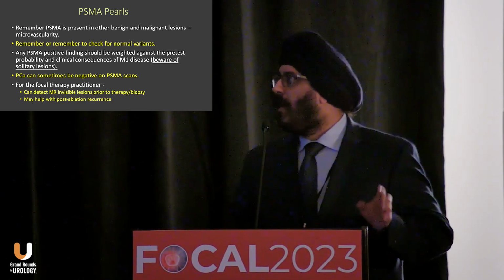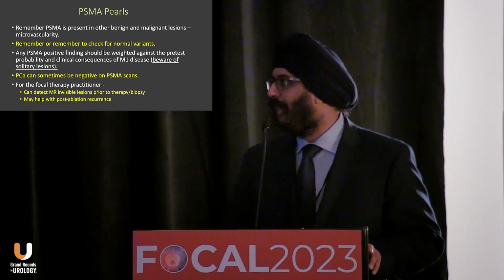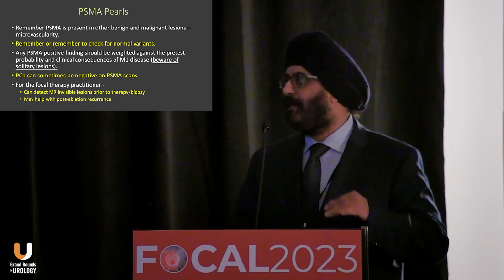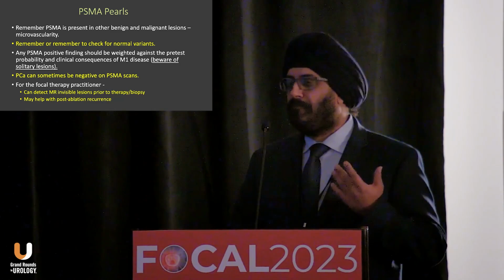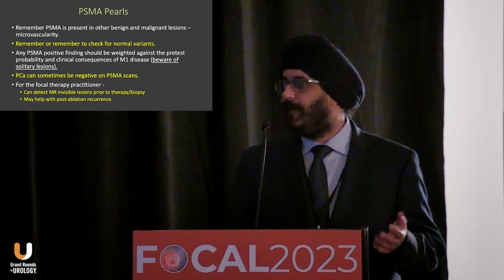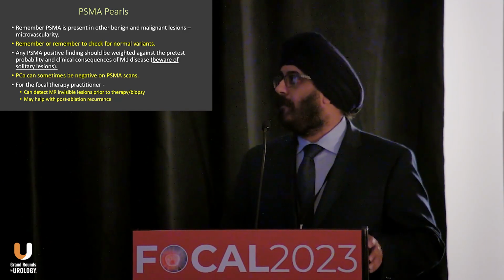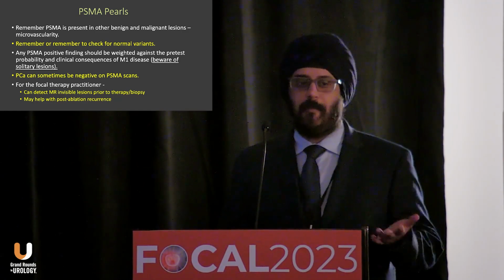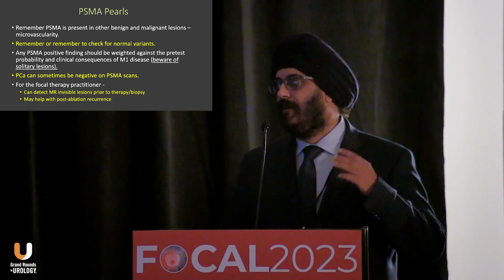All right, so just to start out with getting the pearls out of the way, PSMA is prostate-specific membrane antigen, but it basically targets a lot of vascularity, neovascularity, and any lesion which has neovascularity can have PSMA positivity. You can't remember all the normal variants, so remember to check for them.